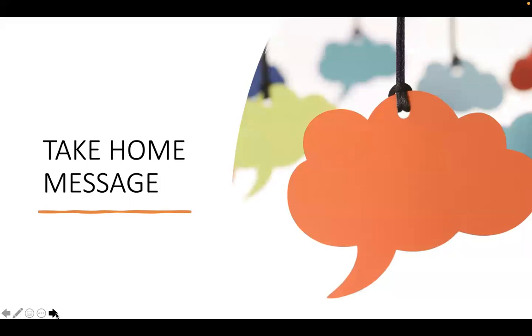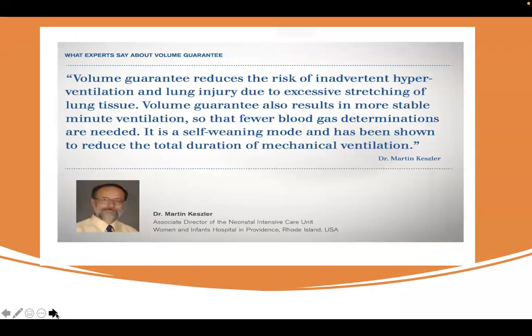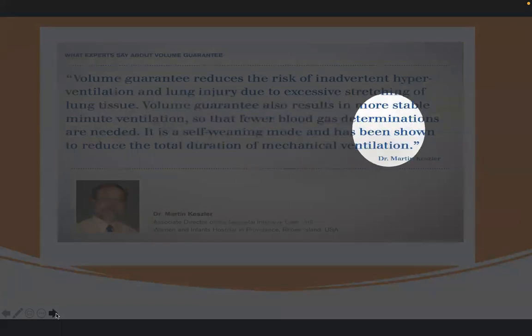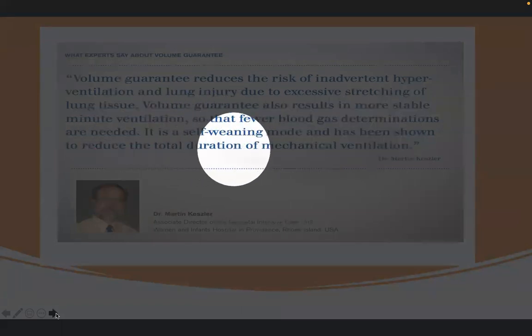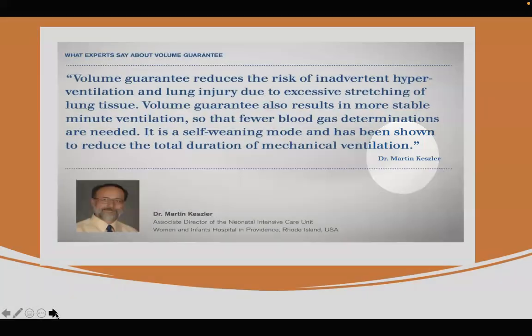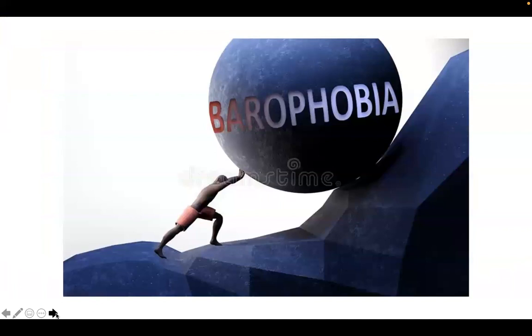So the take-home message that I'd like to give, as the popular saying from Martin Keszler goes: it reduces the risk of inadvertent hyperventilation and lung injury. It also results in more stable minute ventilation so that fewer blood gas determinations are needed. It is a self-weaning mode and has been shown to reduce the total duration of mechanical ventilation. We should not fear barotrauma, but we should rather fear volutrauma.